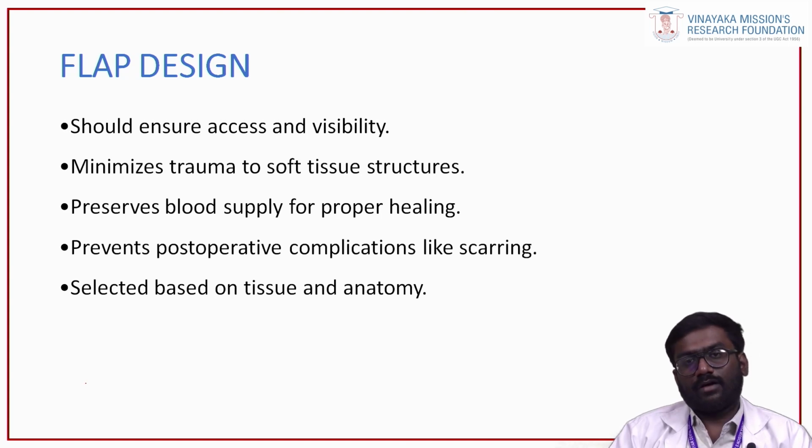Next, adequate care should be taken to minimize trauma to the soft tissue. In other words, the soft tissue should be handled very gently. Once your procedure is done, the soft tissue has to be re-draped to its original position, and it has to be meticulously done. The second is proper blood supply for proper healing. Your flap design should be such that the flap you have reflected receives adequate blood supply so that post-operative healing is not hampered.